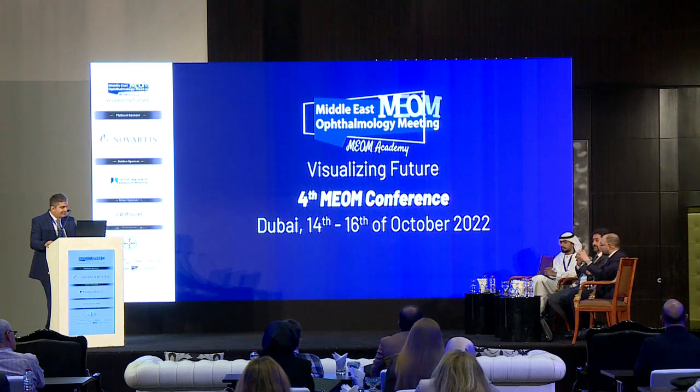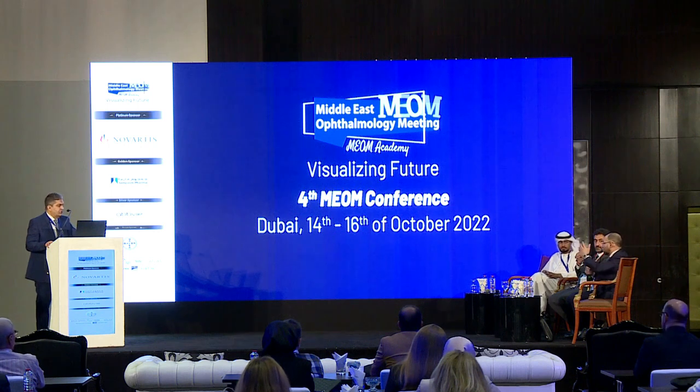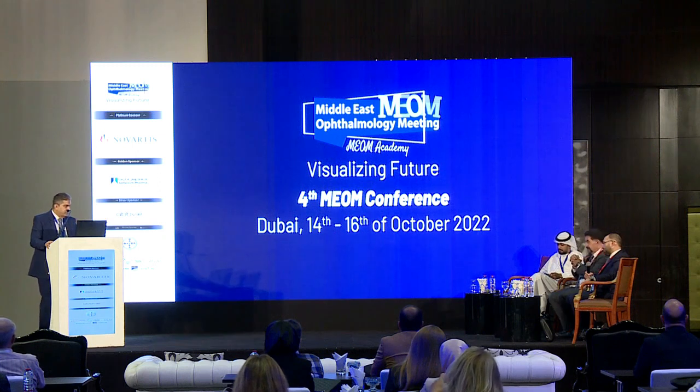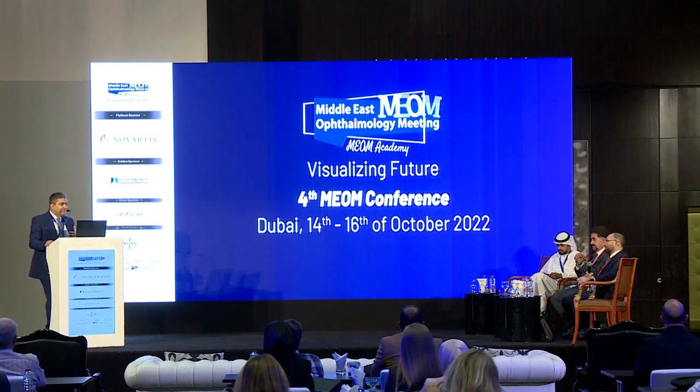Yes. My question is that I had a few patients with normal BAD and abnormal CBI and TBI, so I repeated it again. It was variable, unfortunately. It's exactly the solution as you said: repeat the Corvis a lot of times. Don't depend on only one exam, even not at the same time, but at least it gives you some suspicion.